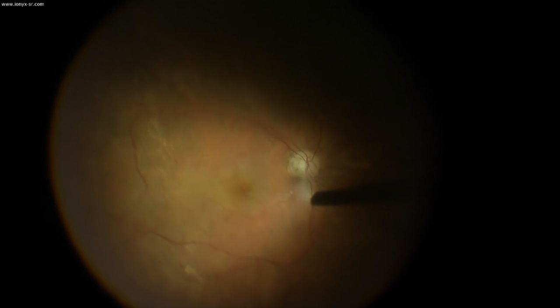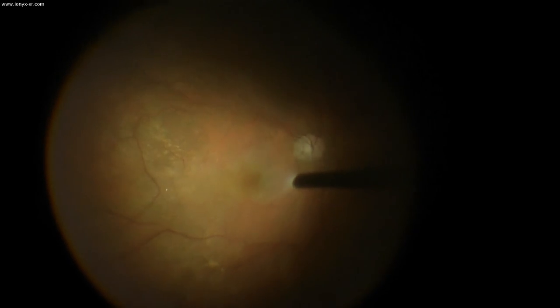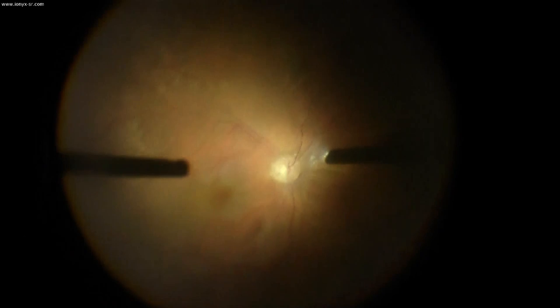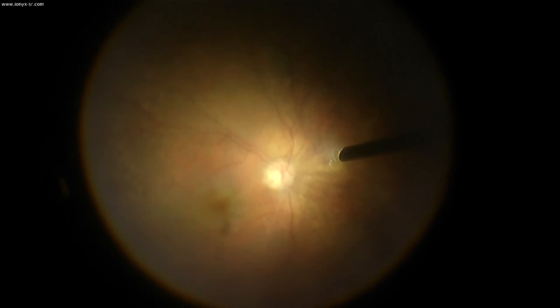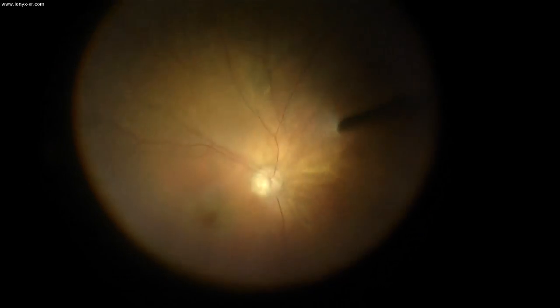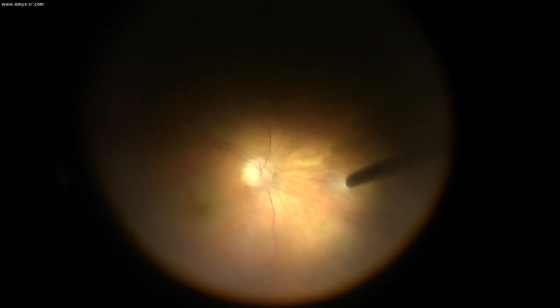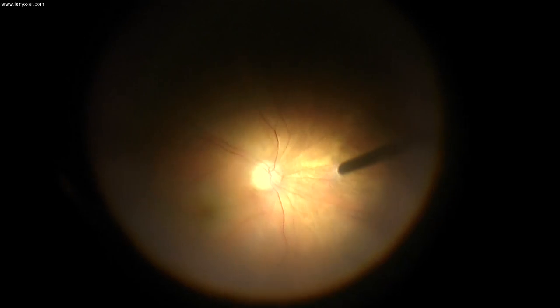Pigmentation in the fovea with the cherry spot. And we can see the vessels, which are extremely thin. And especially in the arteries, you can see that the caliber is irregular.